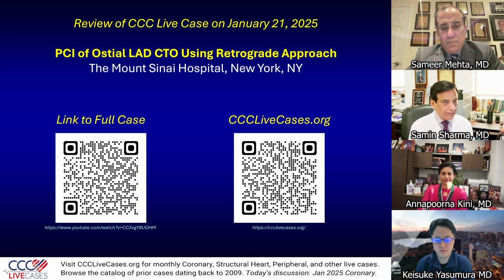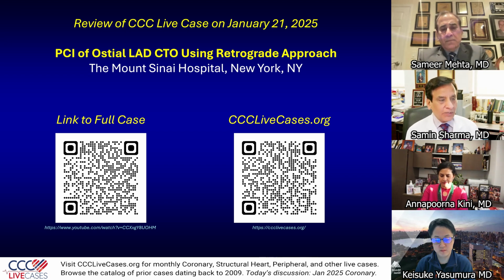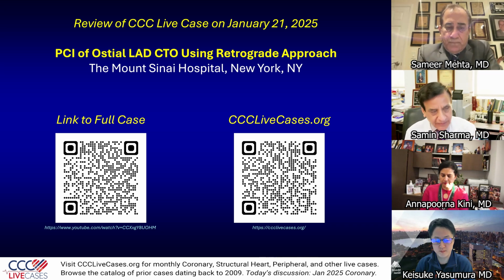I will take it with open arms and learning, because we all learn. When Anu put a wire into the circumflex, then put the wire in, the point is there are various ways to do it. But I think Anu showed her way to do it with minimal trauma and a little bit of dissection, which is inevitable in CTOs. But the final result, with every septal, every diagonal preserved, no left main dissection, and a slight distal tip hematoma of the distal left main covered by two struts of the LAD stent, was a prime example of thoughtful planning and execution of the case.